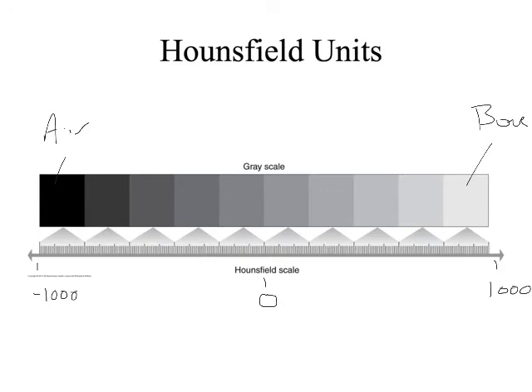Specifically, though, Hounsfield was not interested in air and bone initially. He was interested in water. So out here, the 0 for the CT machine is water. The phantoms that we use a lot of times in radiation therapy are also water. Why did he choose water? Well, because it's cheap and plentiful, and he had to do a lot of tests. So he figured, I could either choose this brick of gold I have here, or I could choose water. I think I'll go with the water.